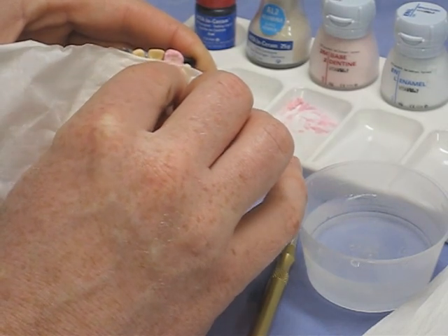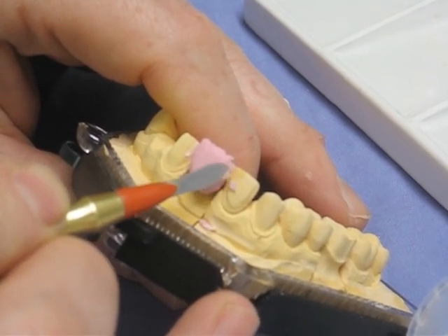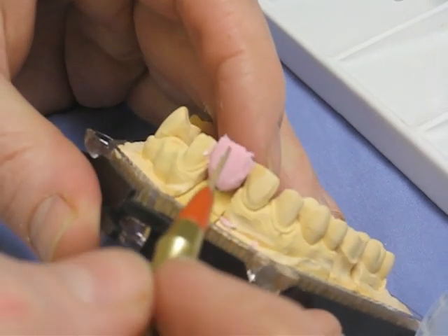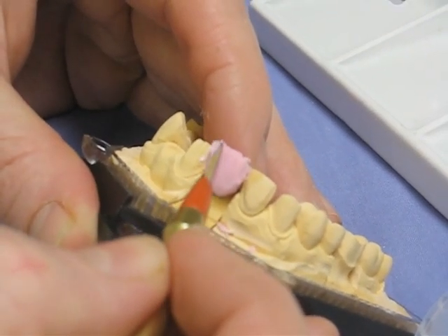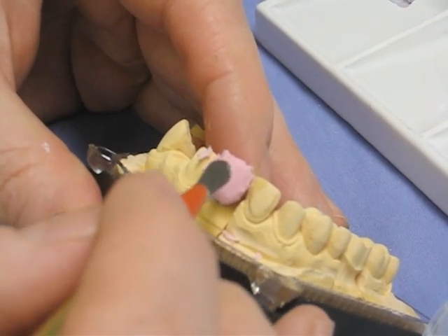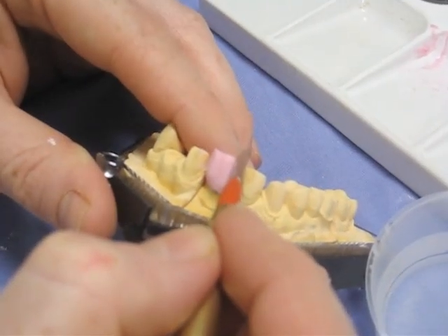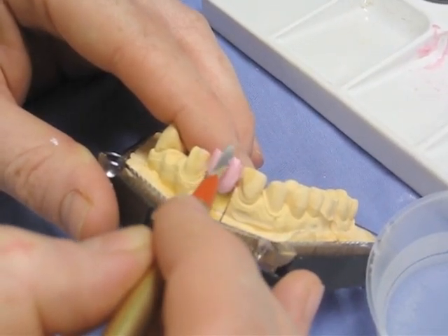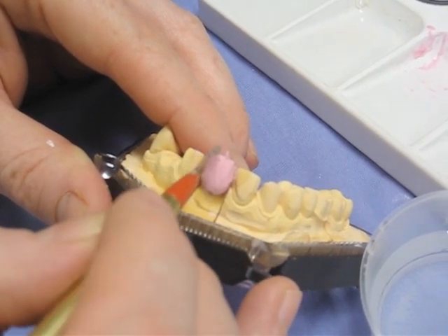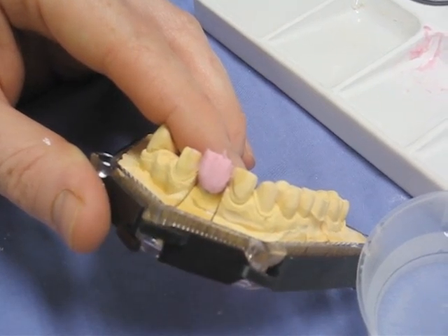The base dentine shade provides a transition between translucencies. This is the cut-back stage: we're taking away material where we want the more translucent enamel areas to be placed. By scratching a couple of grooves into the surface of the incisor, we create the effect of mamelons — the dentine fronds through the tooth — leaving the mamelons and creating some translucency in between them.